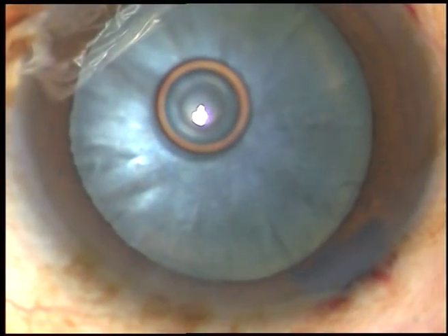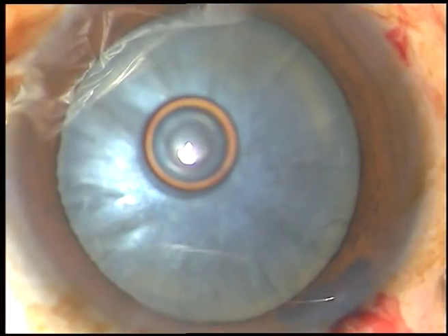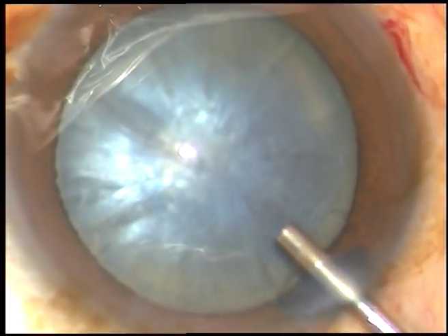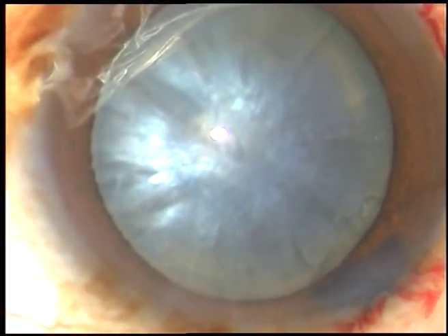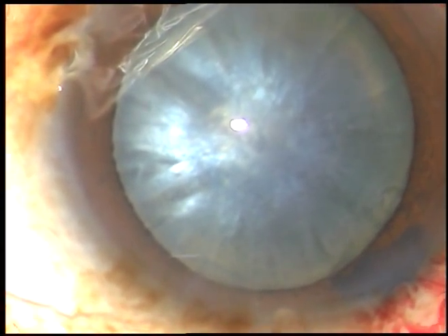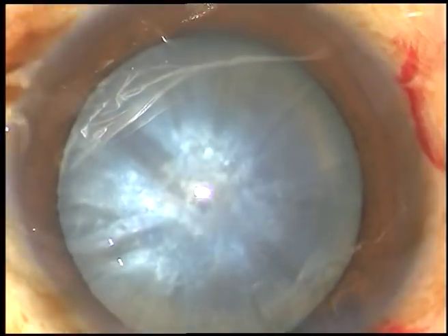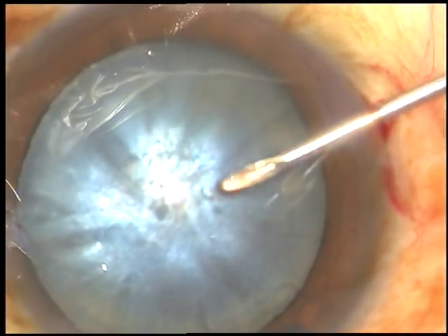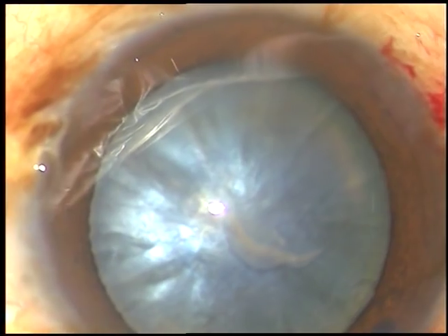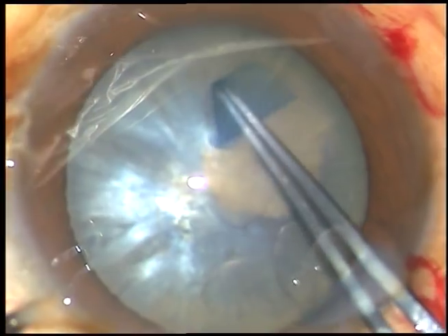Now I am going to use a viscoelastic substance — this is hydroxypropyl methyl cellulose. There is some convexity of the anterior capsule and it appears to be mildly intumescent. There is very minimal leakage of lens matter.